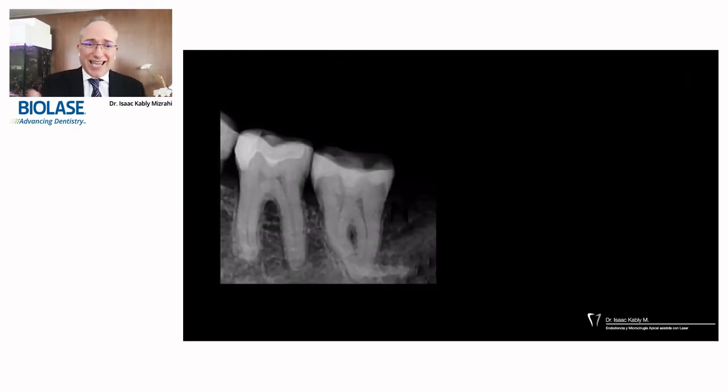This is a vital case for this second lower molar. In vital cases, I use exactly the same protocol as in necrotic cases or retreatments. I just do my conventional root canal treatment. I open my access with the burr, and as explained before, I perform my root canal with water as irrigant inside the root canal.